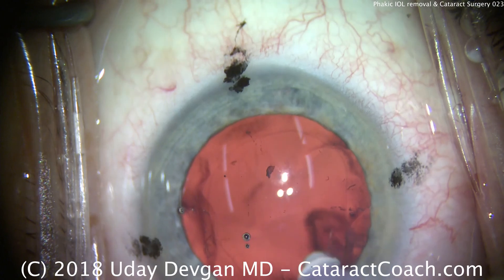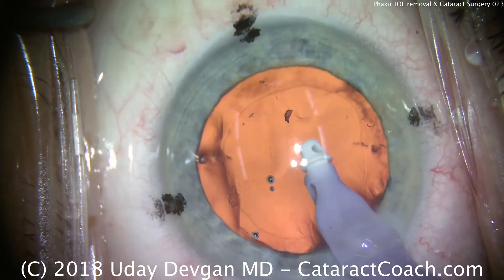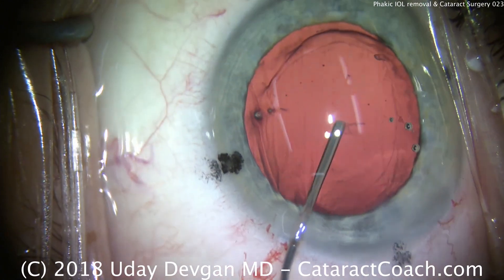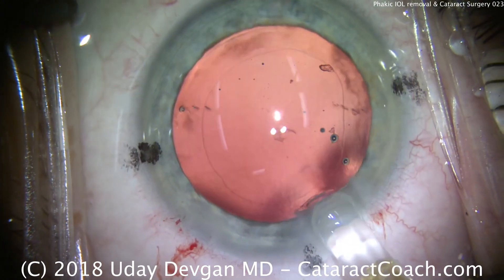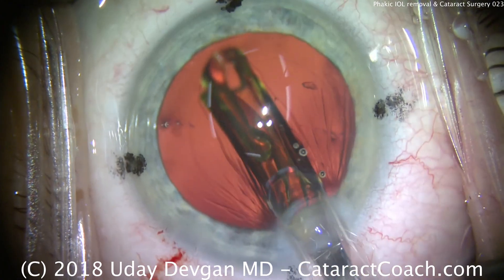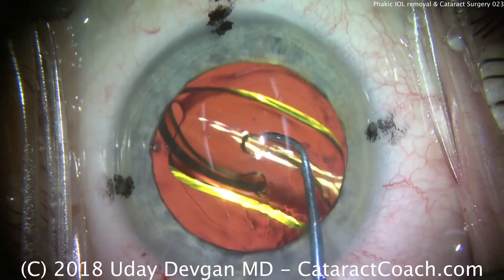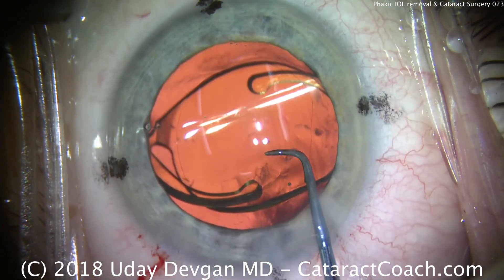Clean up the capsular bag here. Now you can see the toric lens marks more obviously — three dots made in the corneal epithelium. Filling up the capsular bag; with a toric lens in particular, we want a good overlap of the rhexis over the optic edge to keep the toric lens at the correct meridian and axis. Here's the lens being implanted now — a single-piece acrylic monofocal lens with toric correction. For this high myopia patient, we're putting in a lens targeting just slightly myopic, a post-op target of between minus a half to minus a quarter. We're lining up our toric marks, getting them pretty close.